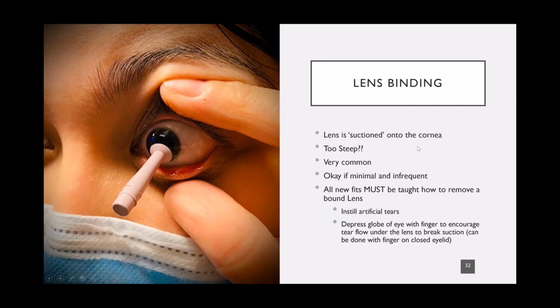Now, if a patient is experiencing lens binding all the time and it's really hard to get off, maybe your lens is too steep, and so you might want to consider decreasing the sagittal depth of that lens by adjusting your alignment curve. But if it is minimal and infrequent lens binding, then it typically is not a big deal.